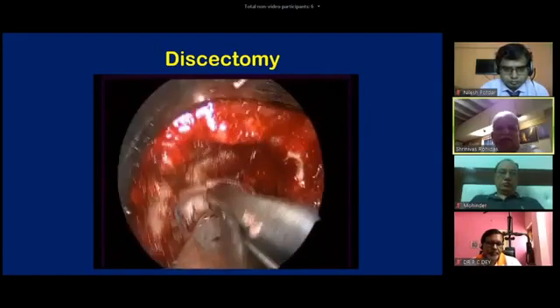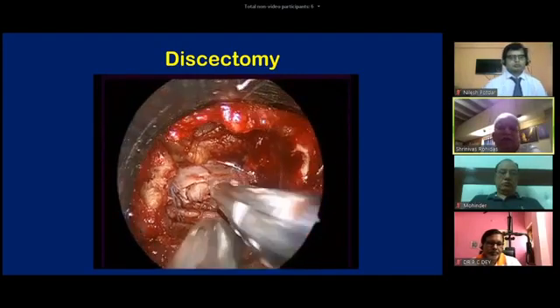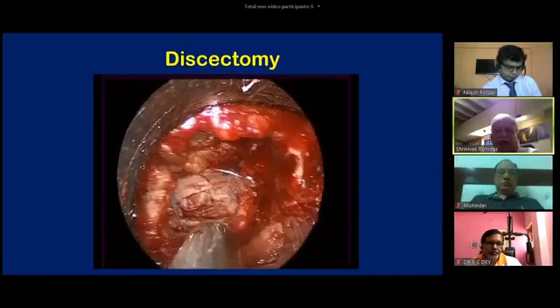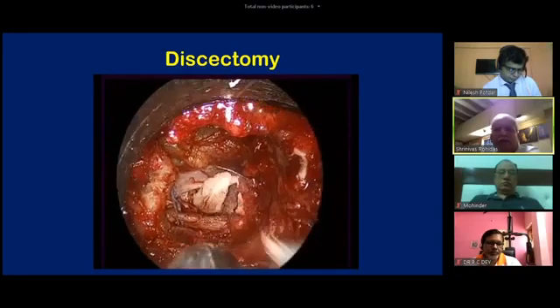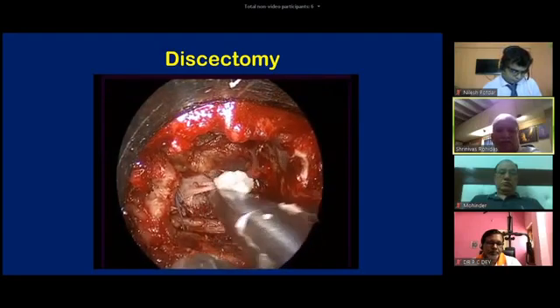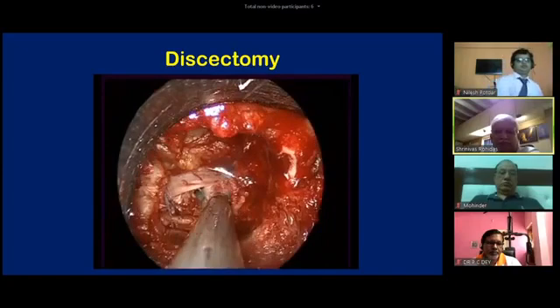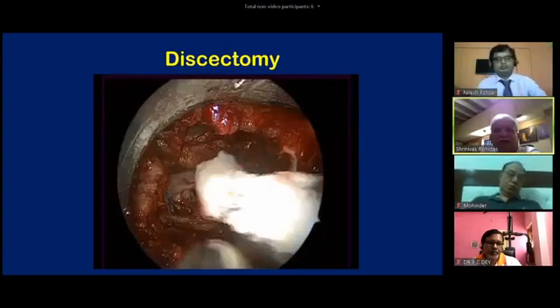I believe in the lumbar region, adequacy of the disc removal and adequacy of the nerve root decompression, one surgeon has to learn that in a particular patient, what is adequate, the surgeon has to decide during the surgery. Everything is under vision. There is no blind spot.